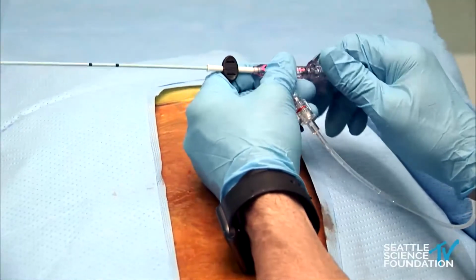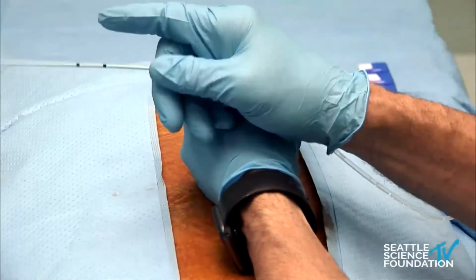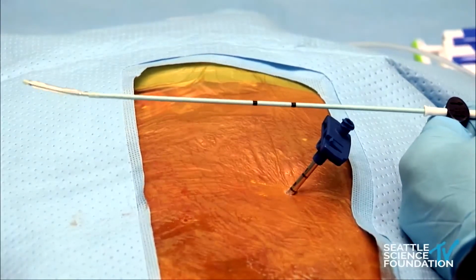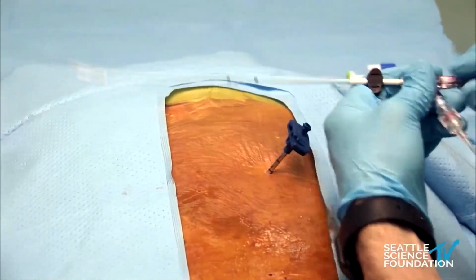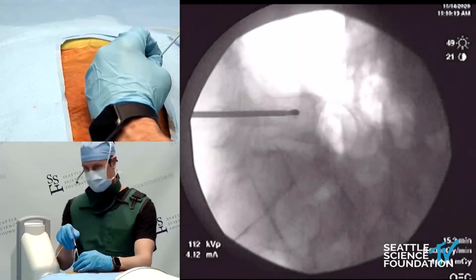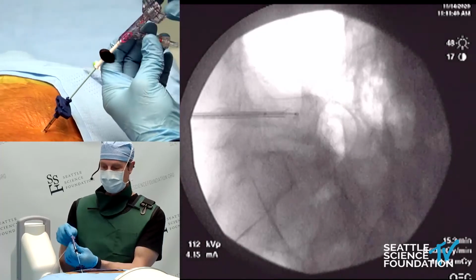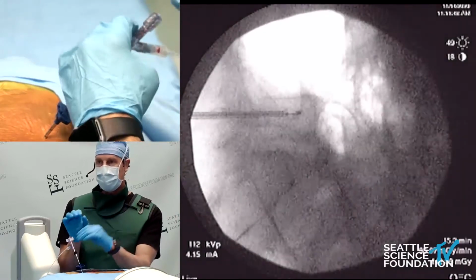This is the device turning mechanism. So this will turn proximally. As you turn clockwise, it turns the tip to exactly the same angle as the power curve. So this will actuate it, and you can straighten it out or curve by turning the proximal portion. So as I put it in, we'll monitor the course. We'll direct it exactly the same way as the power curve, and we'll watch it go in, and I will turn it to facilitate the transgression along that cavity, that canal that was created by the power curve.